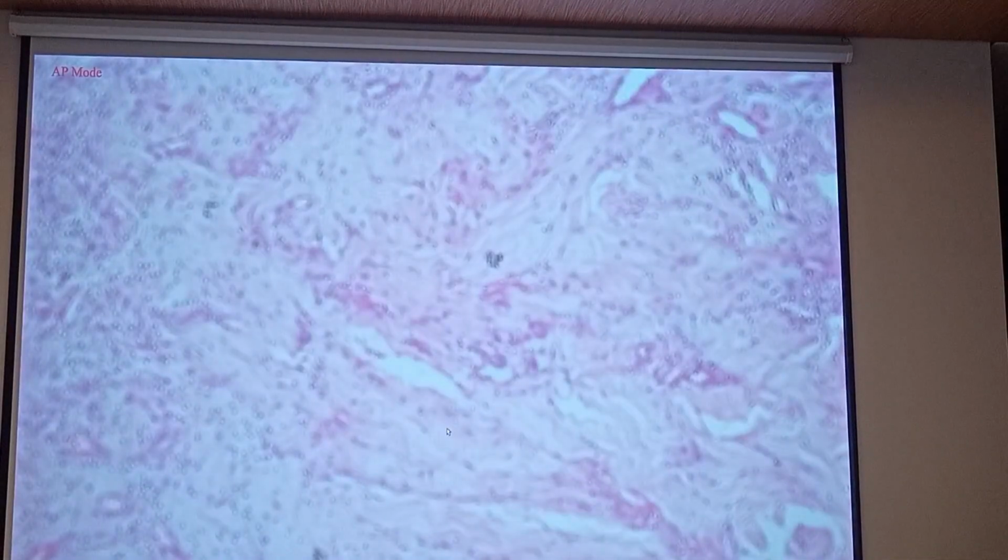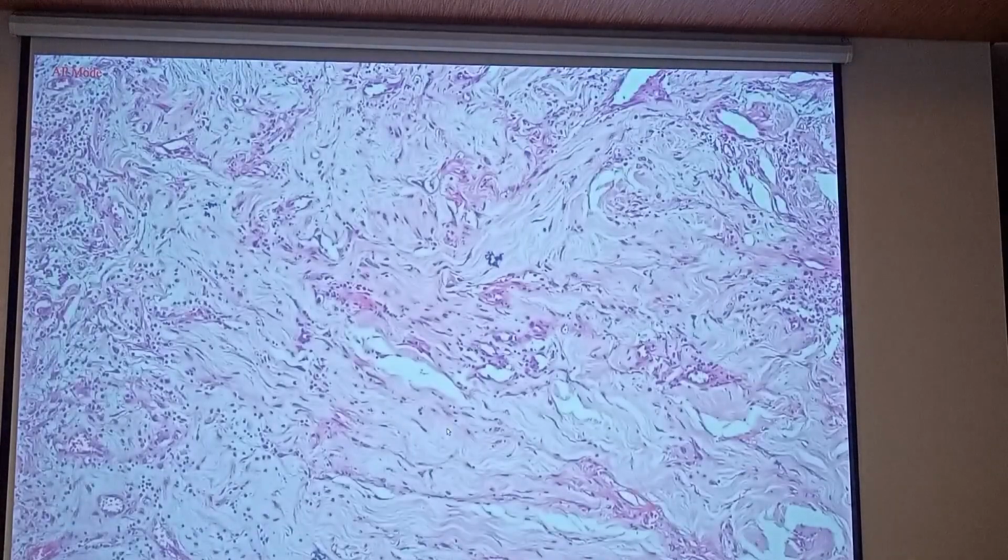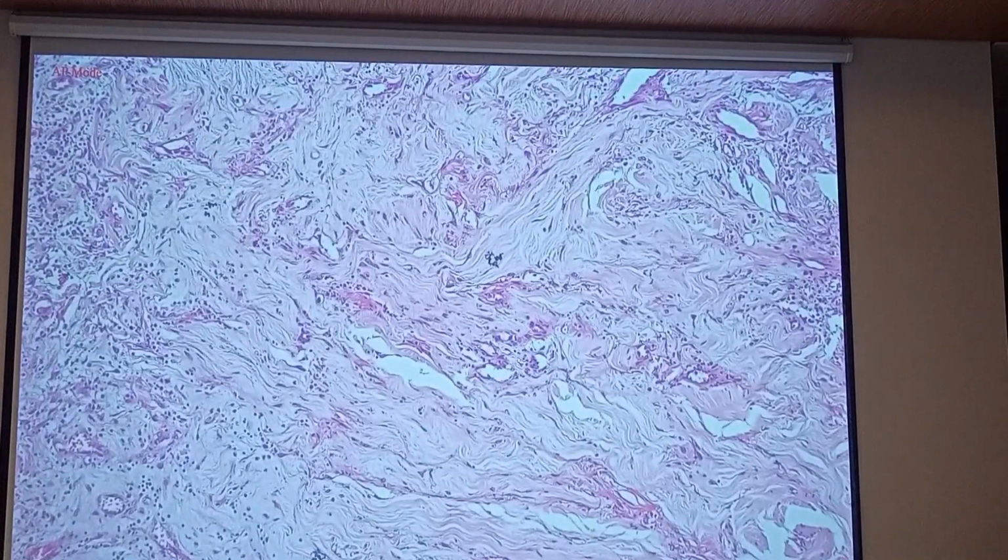No? Now, if you look at the scar tissue itself, what do you see? Thick bundles of collagen fibers. Those are your fibroblasts. And there's still a remnant of the chronic inflammatory response going on because I can see a lot of them here.